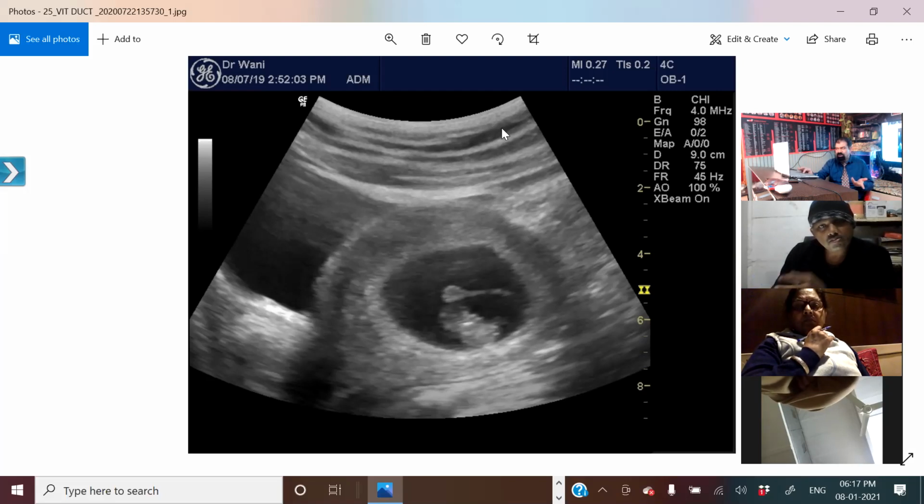And the probe used is the transabdominal probe. And the things will be 100 times more clear on TVS. But the basic important point is set your machine. You should know which knob is for what. At least you have to keep an eye on the frame rate, then frequency also, then the focal zone. Go back to the physics and machine settings.